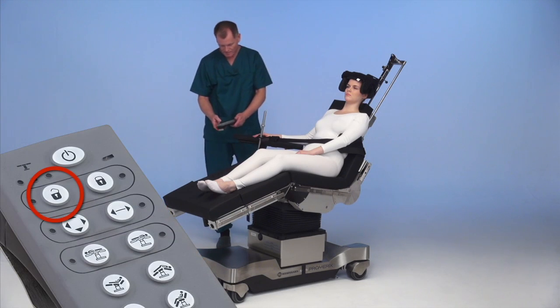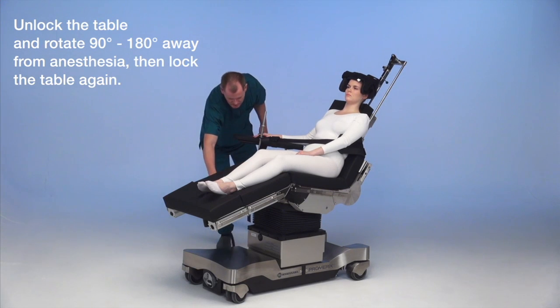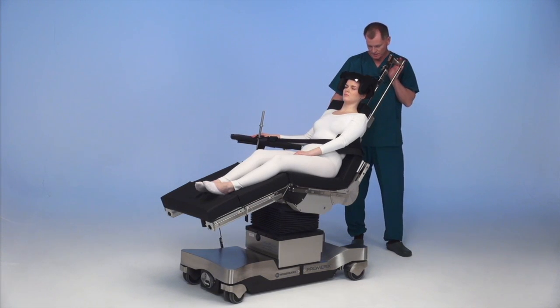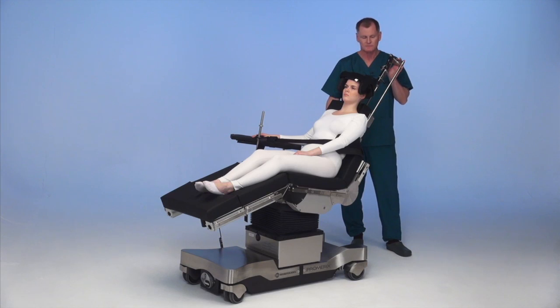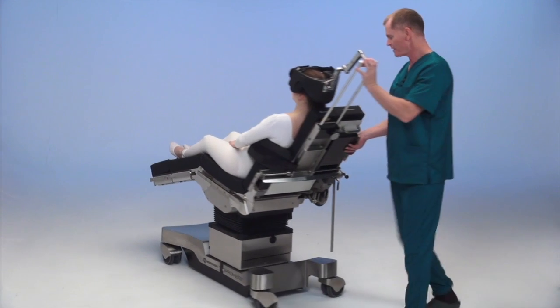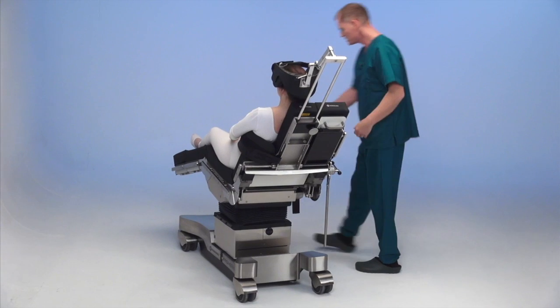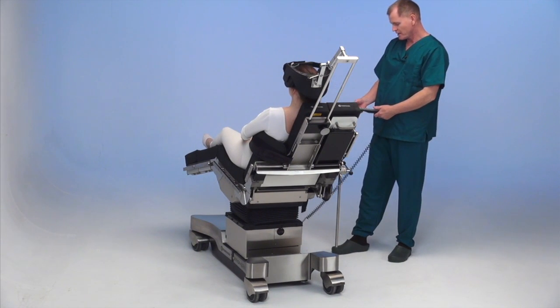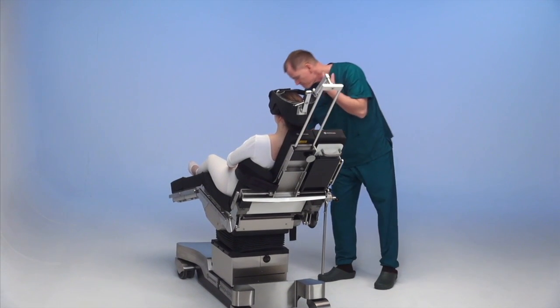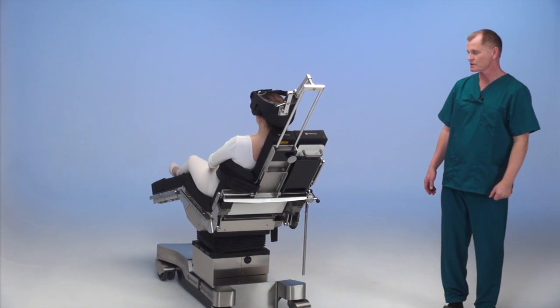We're going to unlock the table and rotate — depending on preference — either 90 degrees or 180 degrees away from anesthesia. The lines are thrown off, and then we lock the table back down. Standard shoulder setup.